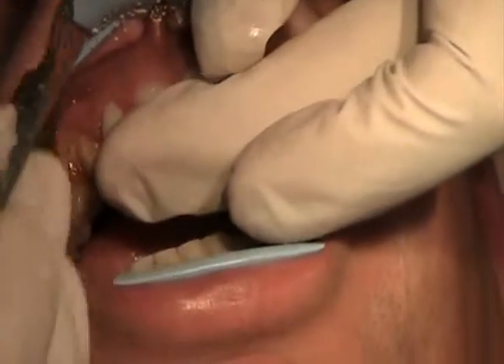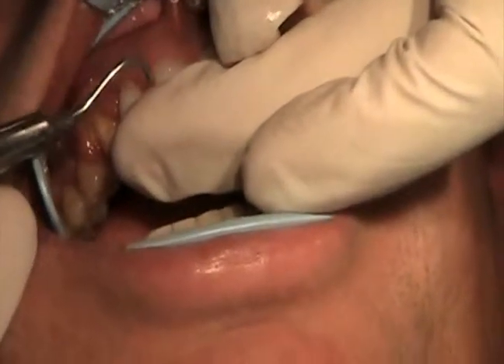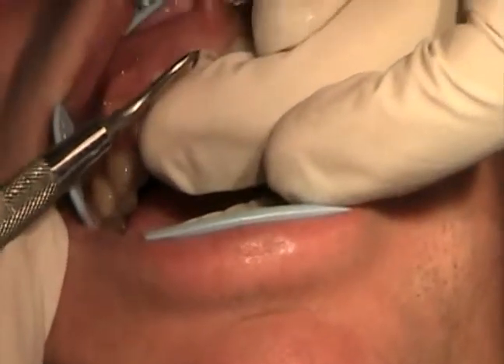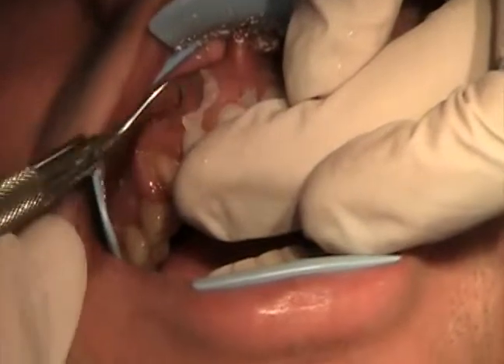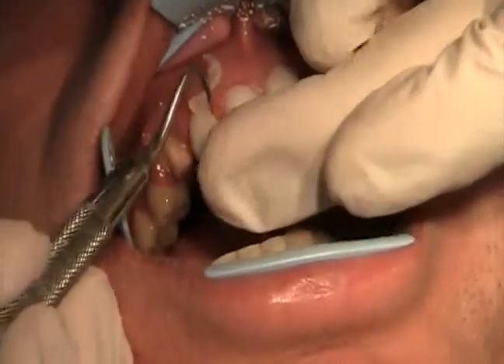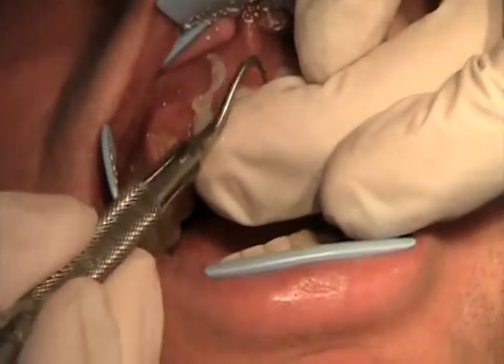The cement can be light cured, so we're able to get it to cure just a little bit — just enough so we can get the excess cement off easily. Then we'll go ahead and cure it fully once we have everything in good shape.